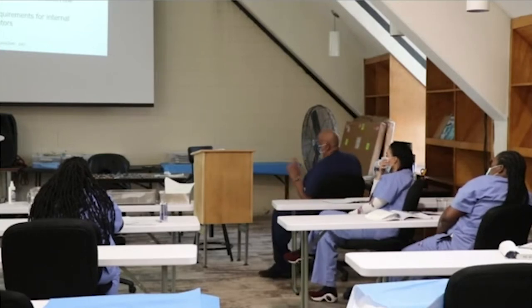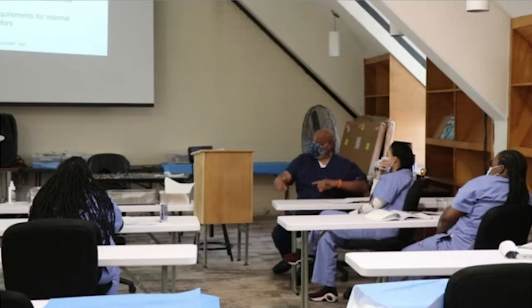Okay. Those are rookie mistakes. If you get in the habit from the start, right? Put your liner and your indicators in. If that's always your habit from go, you will never have your trays disqualified because they don't have indicators. As your manager, I find that hard to defend.